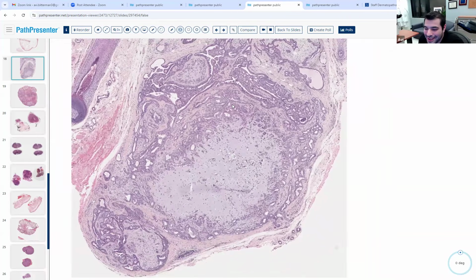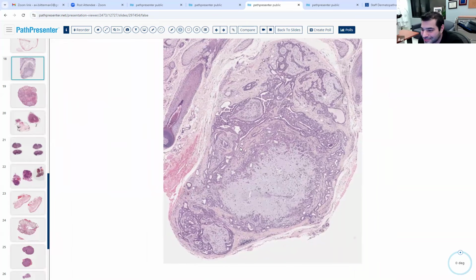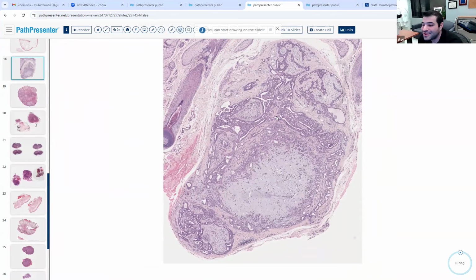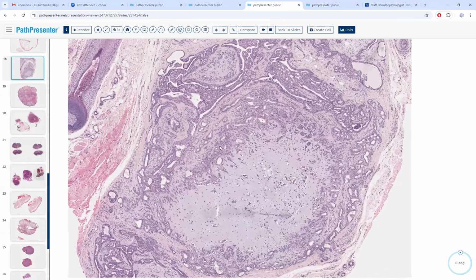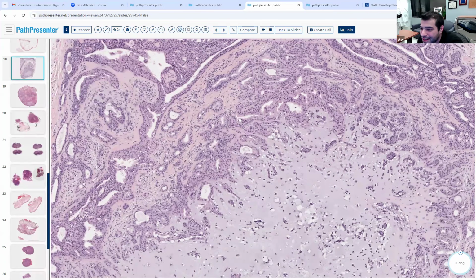Okay, so why are we saying this is a mixed tumor? What are the features? What are we noticing? So you have two components. One is the myxoid stroma. Myxoid or chondroid. Some areas could be myxoid, some areas could be chondroid stroma, and sometimes you can just have one or the other. And then you have the epithelial, apocrine or eccrine component. Yeah, there's an epithelial component.